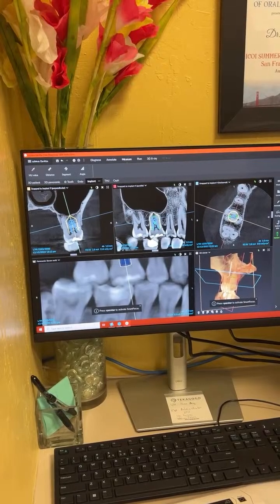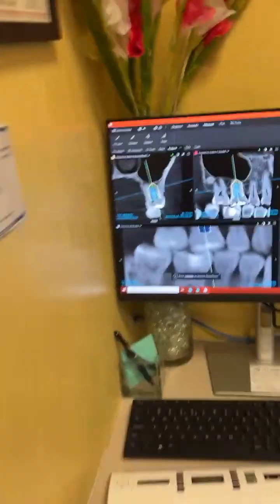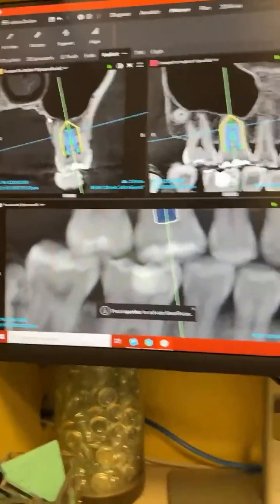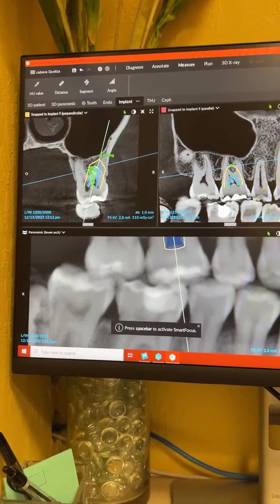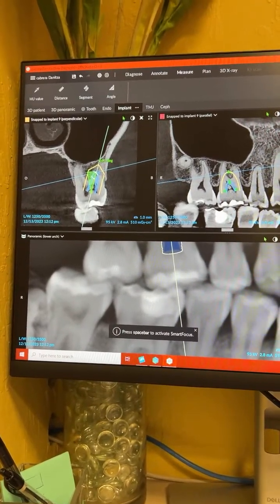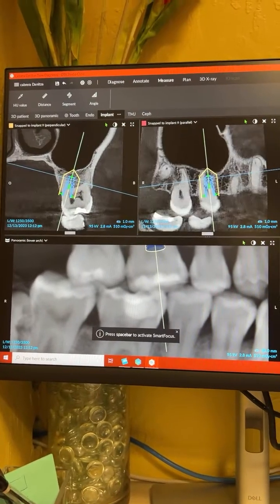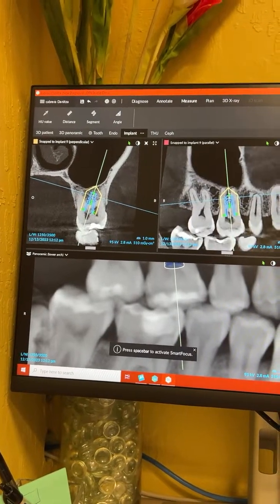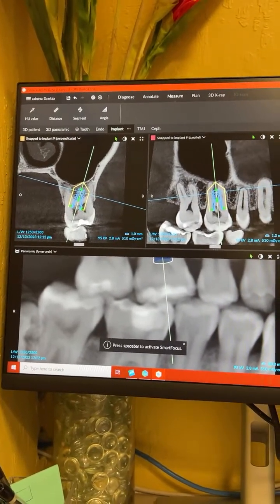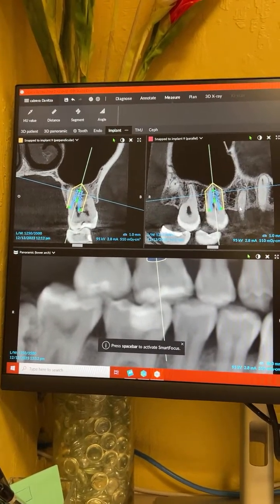Do we have a manual for this? Not really in the software manual, but on YouTube, online, there's all these videos for this. And then you're going to get your training. The clinical trainer will come out here for 4 hours. Then you're going to have 4 hours on a webinar. Actually, this is kind of easy. See, I can manipulate this. I like figuring it out. It's pretty simple.